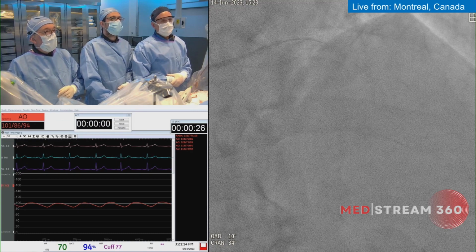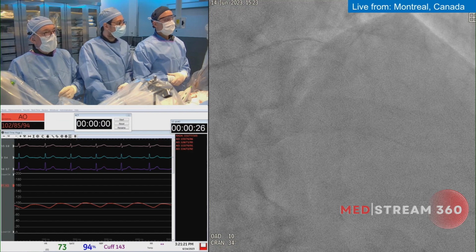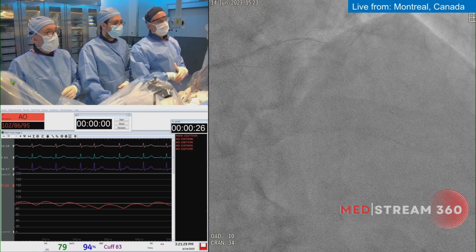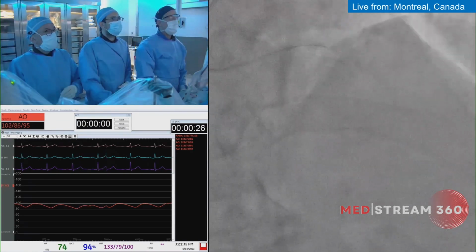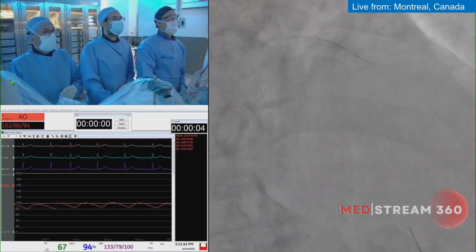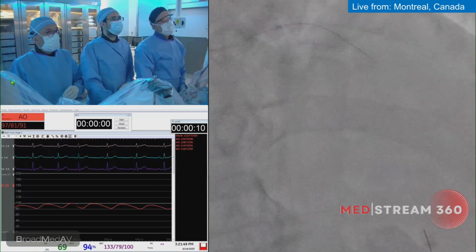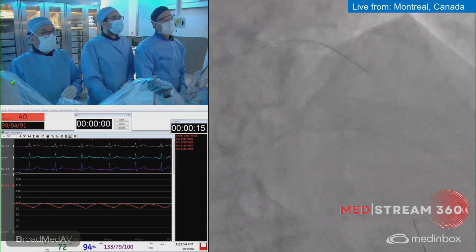One of the challenges here that we haven't foreseen: we are going radial. We are using a 6 French guiding catheter, XB3.5. We don't have the support we wish we had here, so the catheter keeps going in and out. We need to be very careful while doing the orbital atherectomy. Here it's very tight. Resistance a bit there. You have a bit of resistance? I feel some resistance, and still a very high pitch sound, suggesting that we are in a tight lesion.